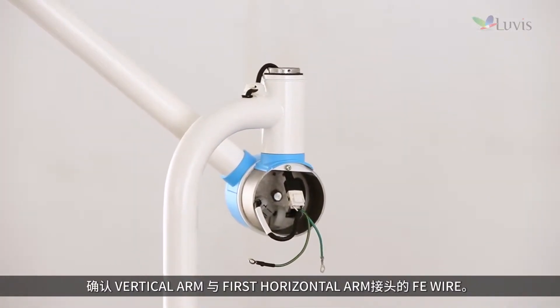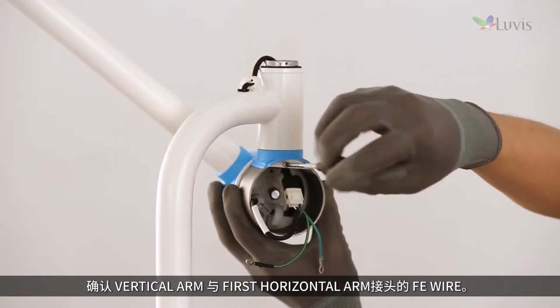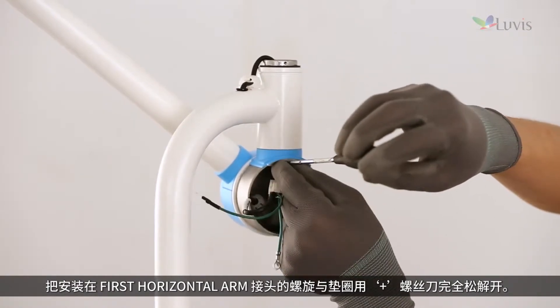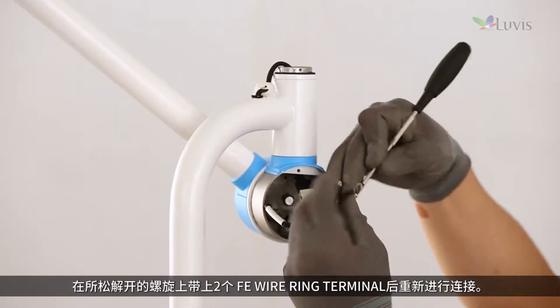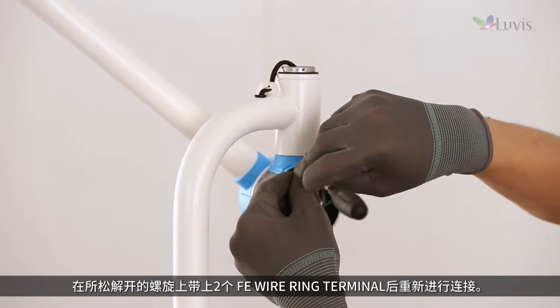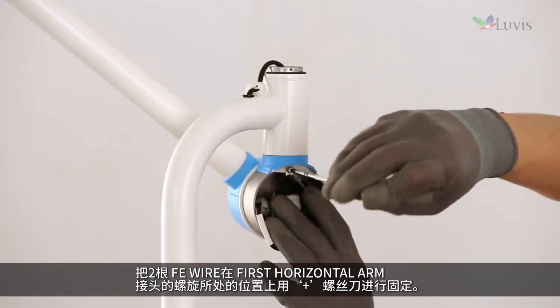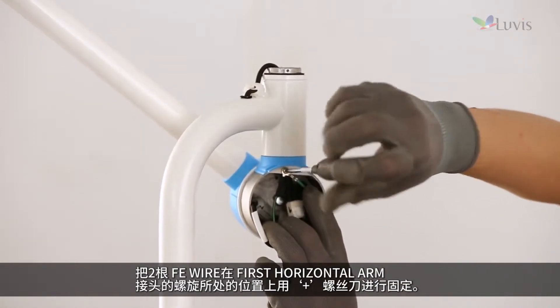Check the vertical arm and first horizontal arm joint FE wire. Completely loosen the screw and washer mounted on the first horizontal arm joint with a plus driver. Put two FE wire ring terminals onto the loosened screw and tighten it again. Fix the two strands of FE wire to the place where the first horizontal arm joint screw was, using a plus driver.